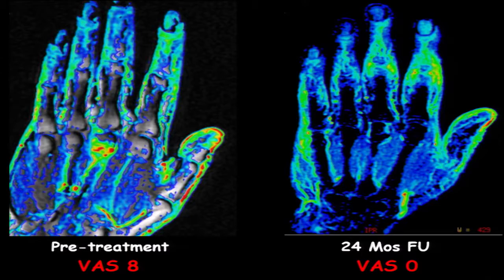This is a perfusion study. What we can see here is another main characteristic of the osteoid osteoma, and that is that the nidus is highly vascularized. Therefore, you can see the high perfusion in that area. And in fact, at 24 months, as we saw before, the VAS is 0, and you don't see any perfusion of that area, which was causing the inflammatory response and the edema that causes the pain.